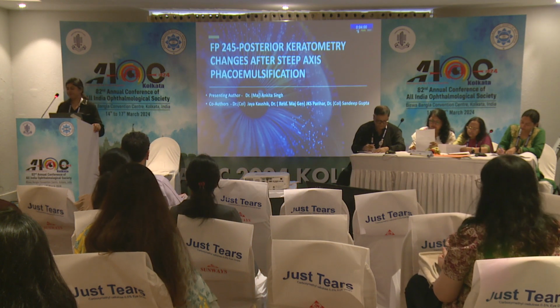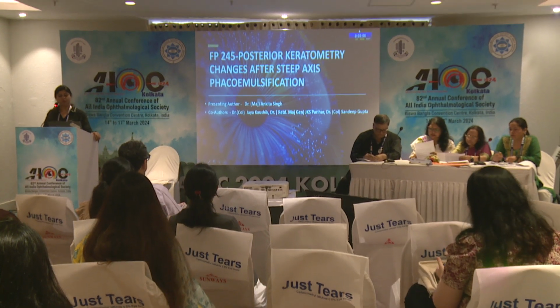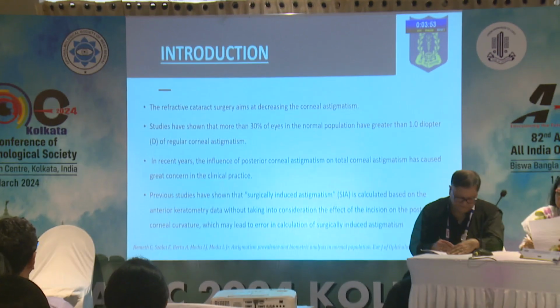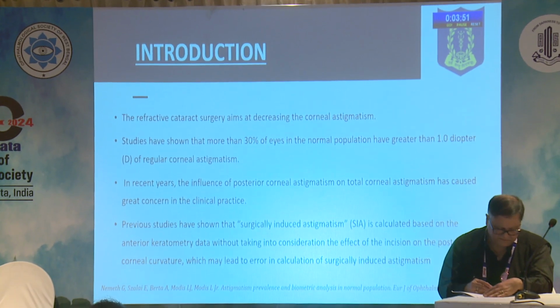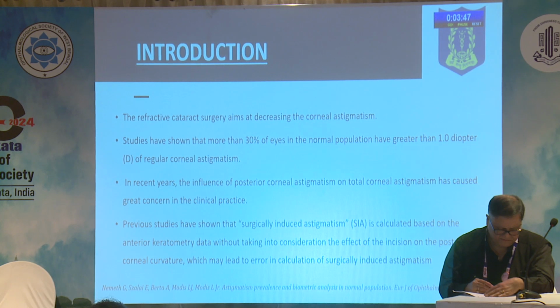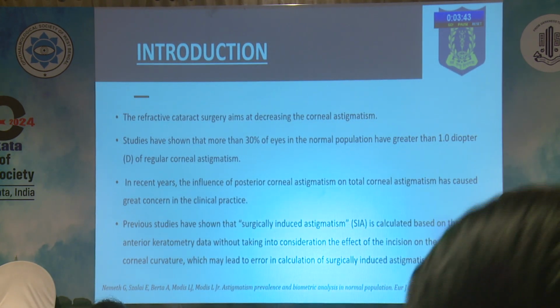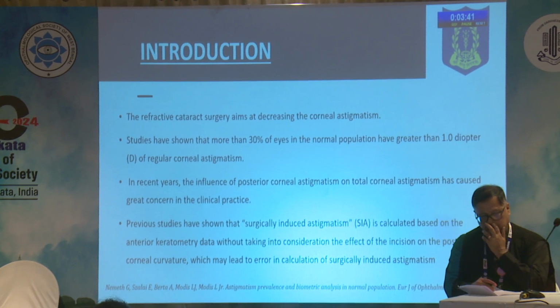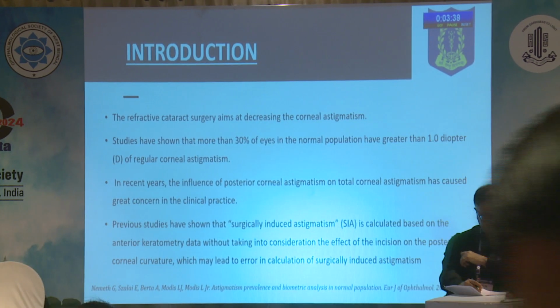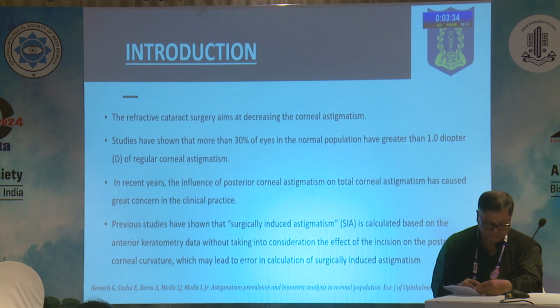Good morning, everyone. My topic is on posterior keratometry changes after steep axis phacoemulsification. Presently, it is a generation of refractive cataract surgery where everybody wants emmetropia. In our study, we have tried to find out the influence of posterior corneal astigmatism on total corneal astigmatism, because so far, due to the primitive devices which existed earlier, only the effect of anterior keratometry was taken into consideration while calculating the surgically induced astigmatism.